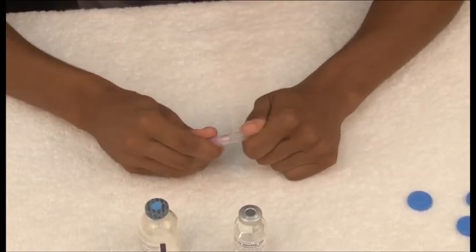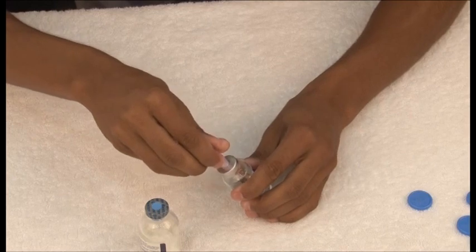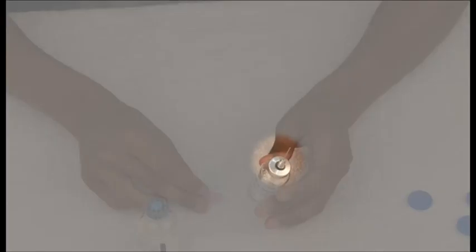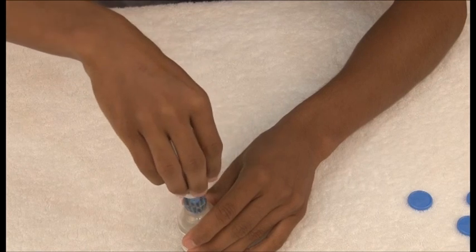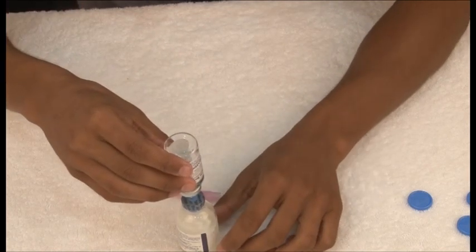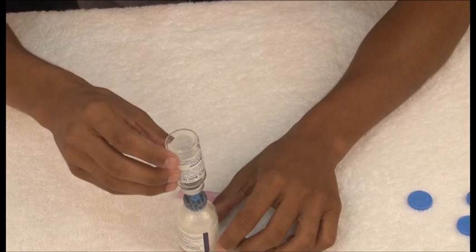Remove the cap from the short end of the double-ended needle and insert the exposed needle through the stopper of the diluent vial. Remove the cap from the long end of the double-ended needle. Rapidly insert this free end through the factor vial stopper at its center, making sure the diluent vial is on top and the factor vial is below.